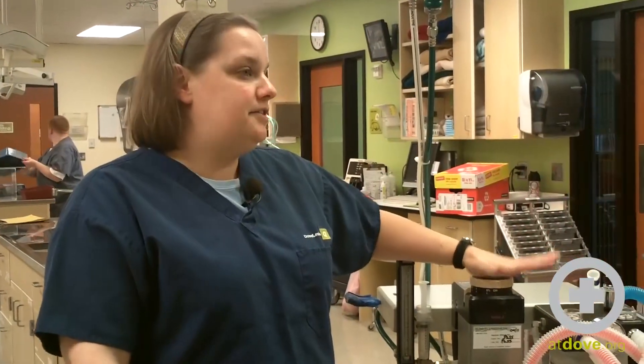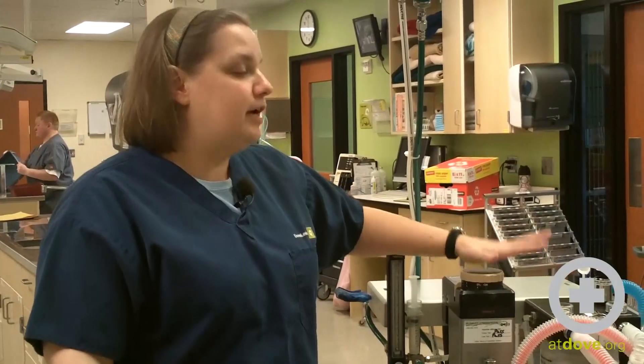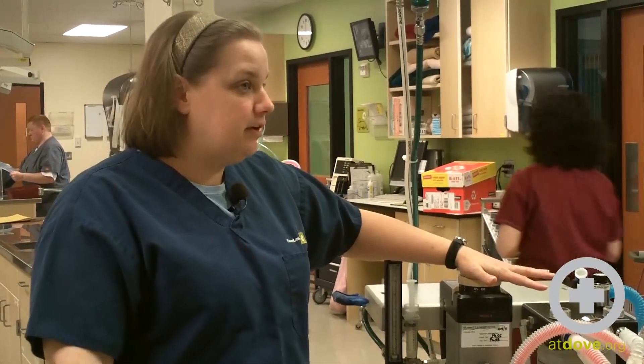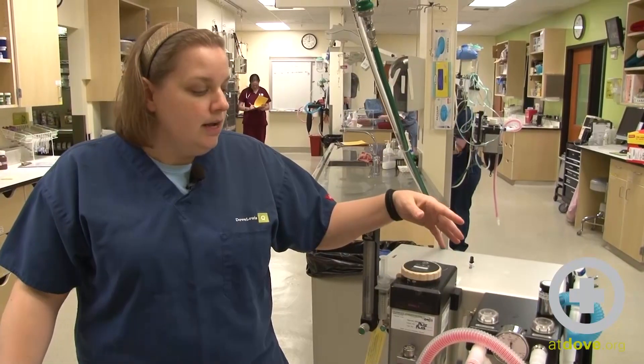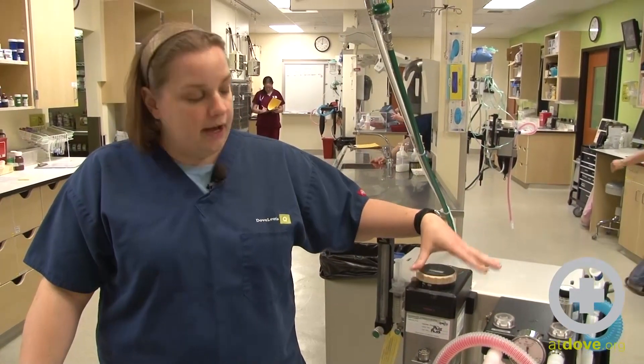Hi, I'm Megan. Today we're going to leak test the anesthesia machine. Leak testing the anesthesia machine is something that should be done before every anesthetic procedure that you perform in your hospital. It's going to make sure that all of your equipment is working correctly, that your scavenging system is pulling out gas, it's not leaking into the room that you're in, and it's just good practice to do that.